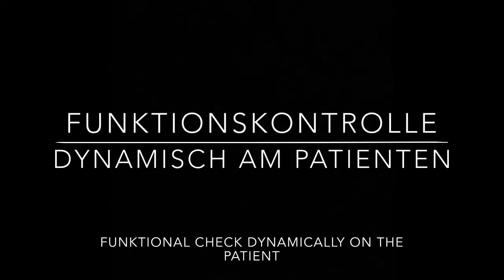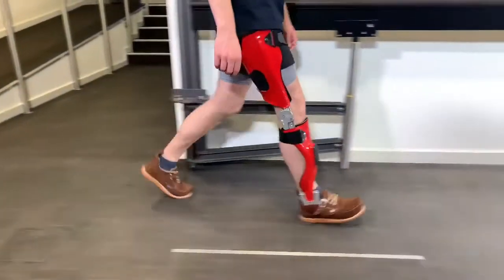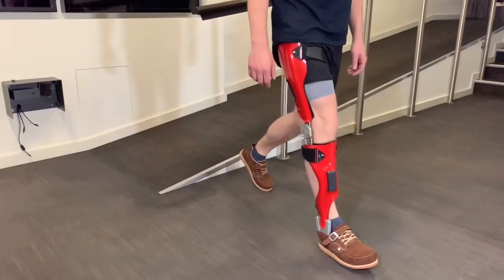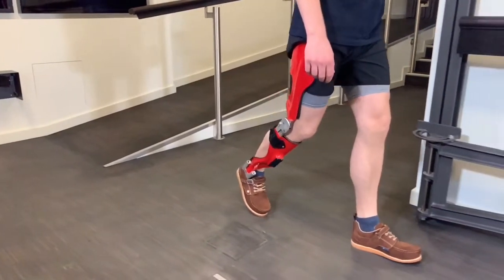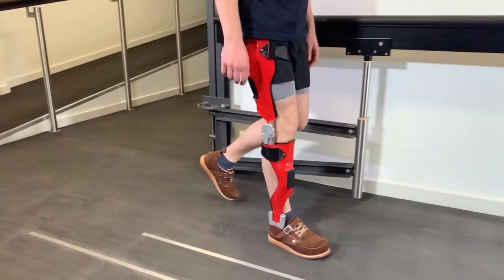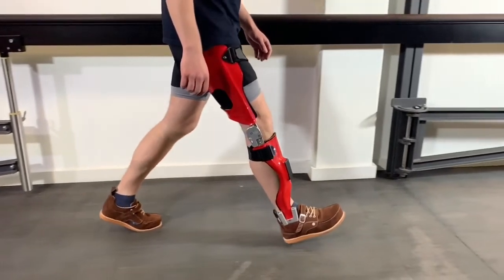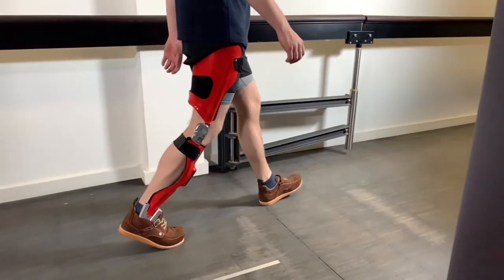To start the dynamic alignment of the joint, the user should always make the first step with the affected leg. Always look at a series of steps and observe the orthosis from bottom to top. Ideally, we should see an initial contact, a controlled loading response, a slight dorsiflexion in late mid-stance, and a noticeable heel-off in the terminal stance. The Neurotronic joint will unlock before the swing phase reliably, but only if the extension moment produced by the floor reaction force on the forefoot lever is greater than the flexion forces on the joint.